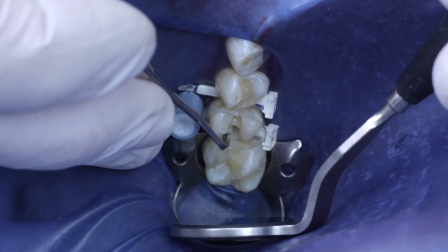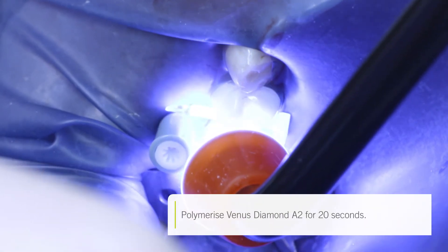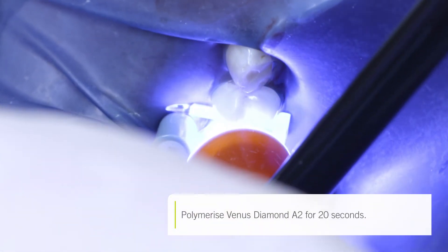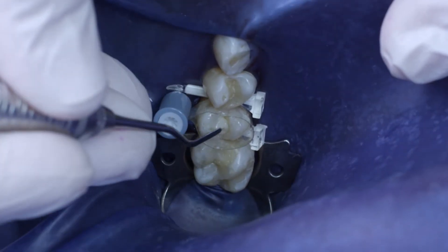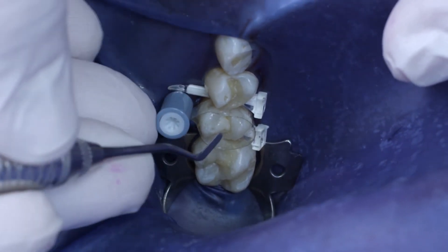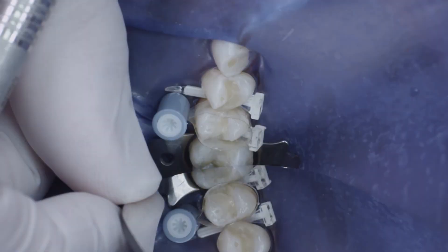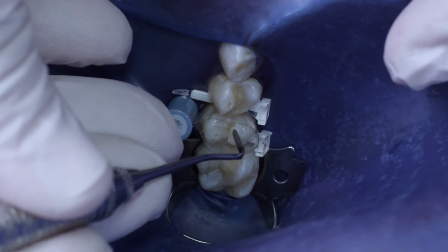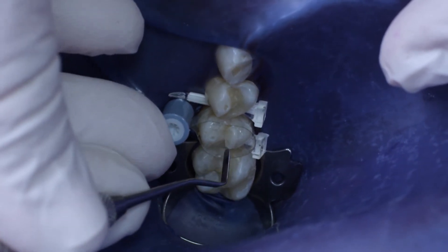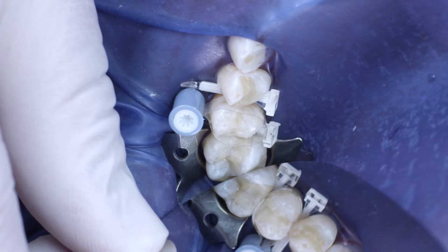I then applied Venus Diamond A2 to the distal area of the tooth. The same material was used to model the buccal triangular ridges. I then modeled the final morphology of the occlusal surface, creating additional angled ridges and forming the marginal ridges.